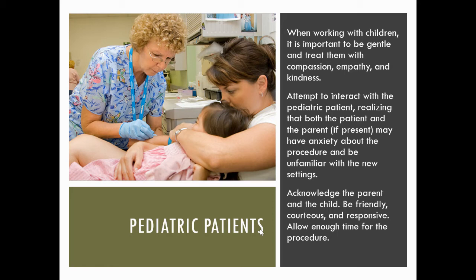And we need to acknowledge the parent and the child. Be friendly, be courteous, and be responsive. Allow enough time for the procedure, because sometimes you need to puncture again when the child moves.